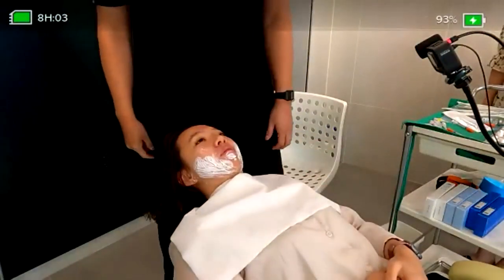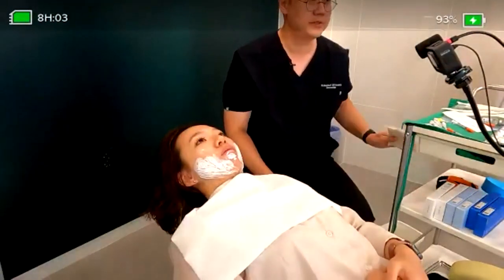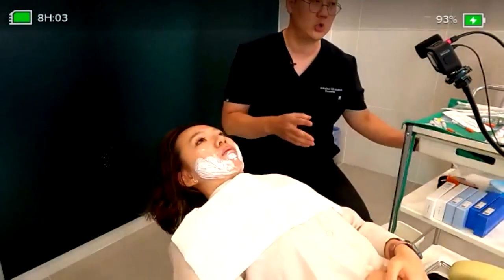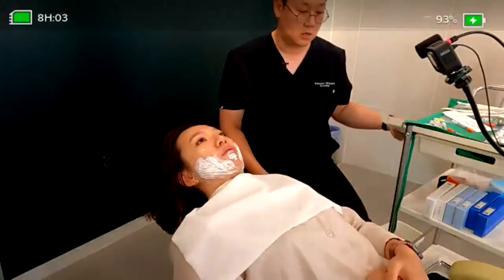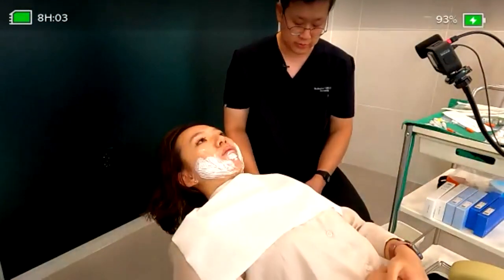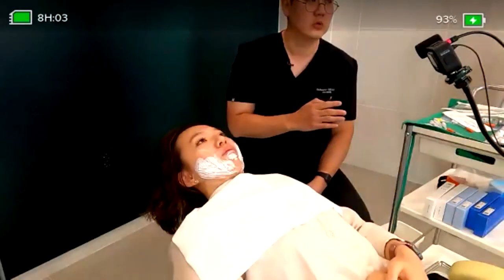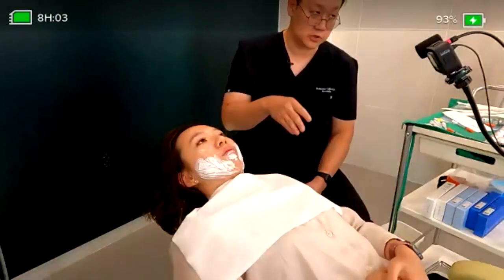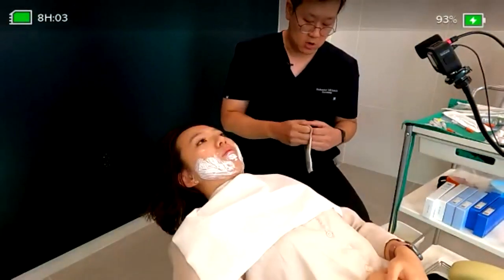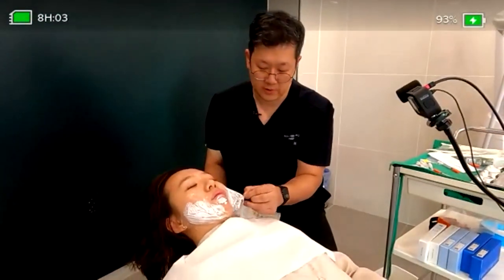So we have a beautiful lady here, and her concern about her face is that she has a pretty cute-looking image for her contours, but usually the tendency among young Korean women is toward sharper contours compared to her. So we will check the coverage here, and we will go with 5 by 5 for how we can design it. We will remove the local anesthesia first from this slide.